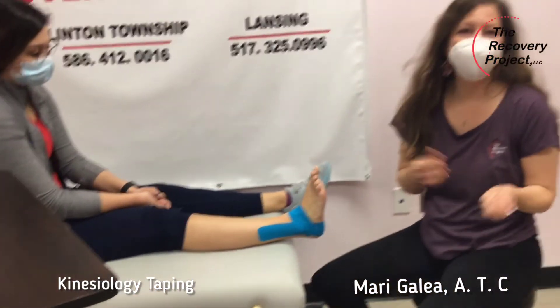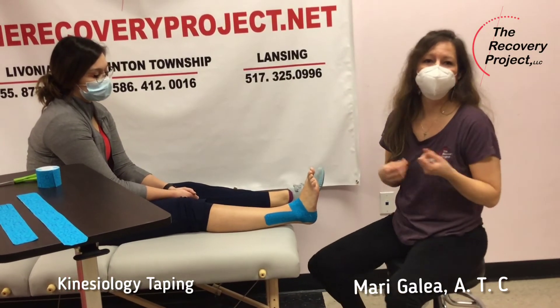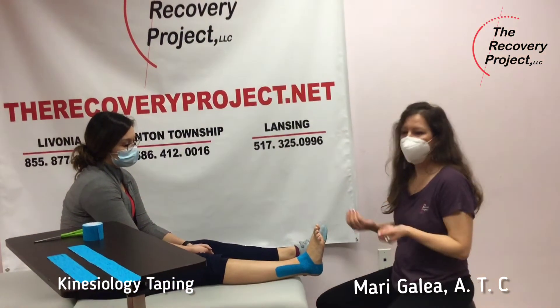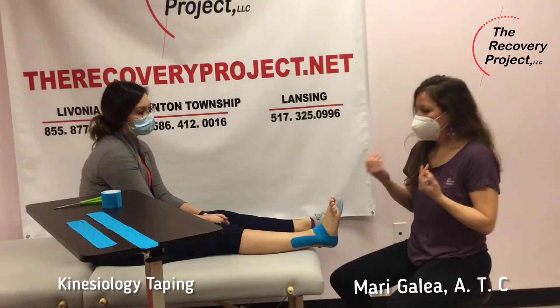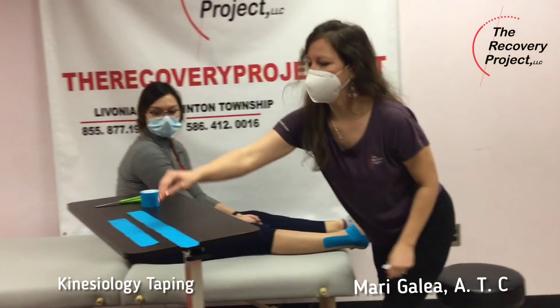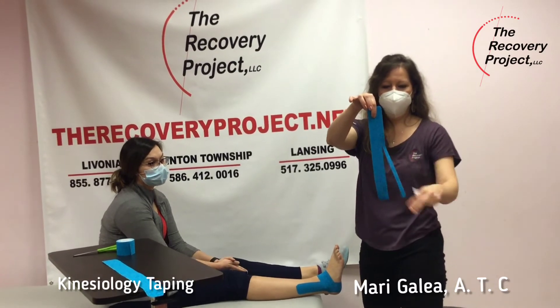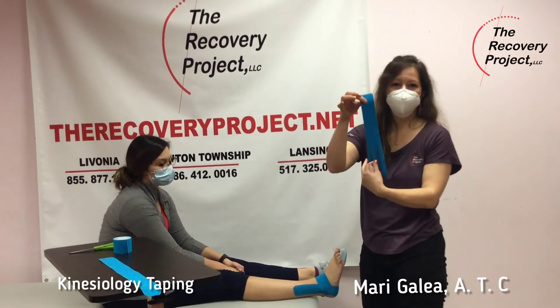So this is one of many techniques that we do for taping. We can do various joints — shoulders, knees, hips — and there are different purposes for the taping depending on what the client needs, whether they have pain, swelling, or need joint stability. There are also other taping techniques that we do with fanning, which is pretty common with lymphedema — it helps facilitate lymphatic drainage and promotes circulation.